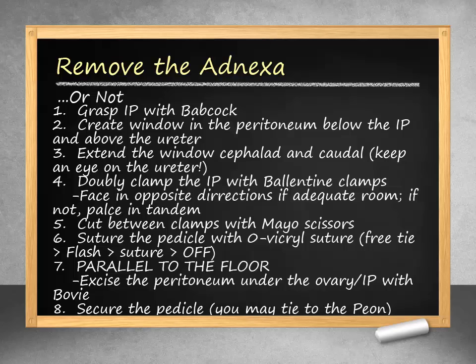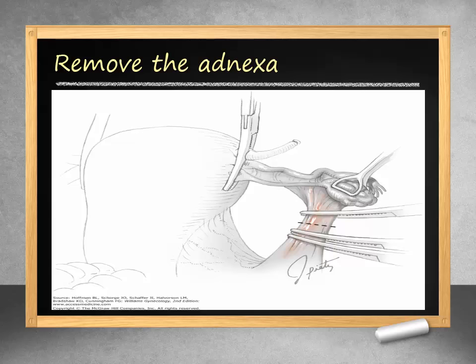Ballantyne clamps are then used to doubly clamp the IP through the window. Two Ballantyne clamps will be placed proximal to the IP with one clamp facing in the opposite direction close to the uterus. Mayo scissors are then used to cut between the clamps. The IP pedicle is then suture ligated, first with a free tie, followed by removal of the back clamp with flashing of the remaining clamp. Suture ligation is then performed with a transfixion suture and the clamp is removed while tying and securing the suture. We now have a freed IP. The peritoneum below the IP and ovary is then excised parallel to the floor with electrosurgery. This is performed on both sides if possible and needed. This graphic depicts proper removal of the adnexa.